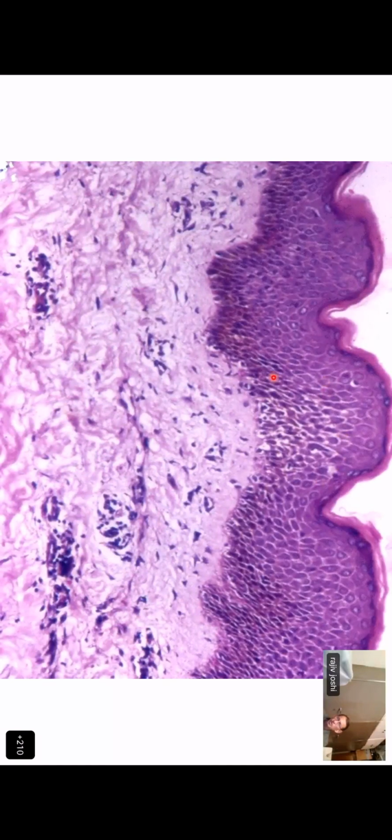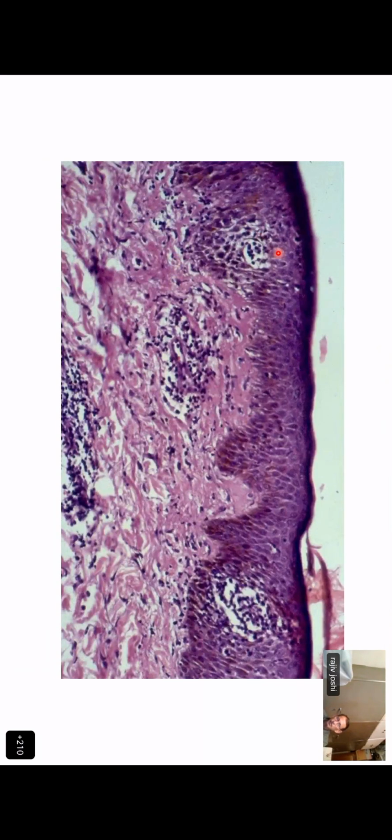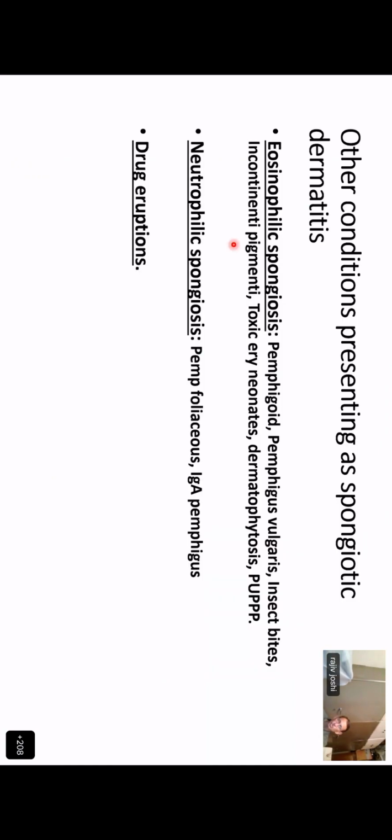If you see mild spongiosis, there's no vesicle, but the cells are separated from one another. There are a few lymphocytes. Another example where you have two foci of spongiosis. Here there are more lymphocytes. And these are also known as pseudo-Pautrier collections, as against the Pautrier collections that you get in mycosis fungoides or in Sézary syndrome. So this is pityriasis rosea or focal spongiosis.